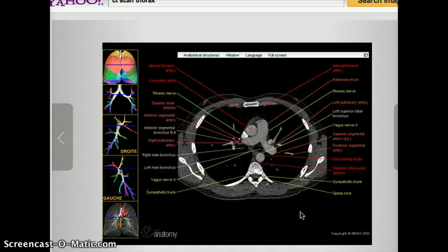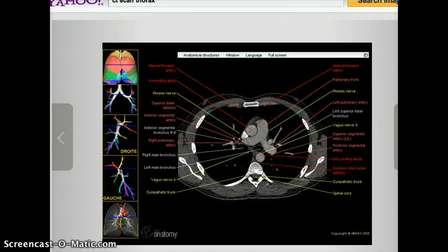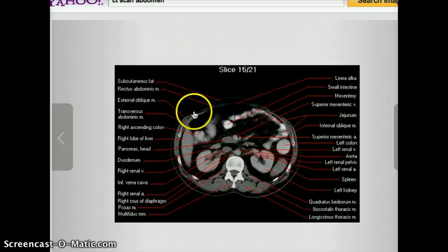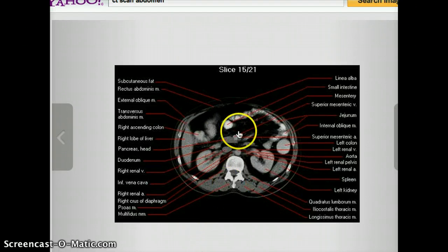I don't see the esophagus, which is kind of interesting — I usually see the esophagus at a thorax level but in this case I don't see it. So let's move on to a CT scan of the abdomen.